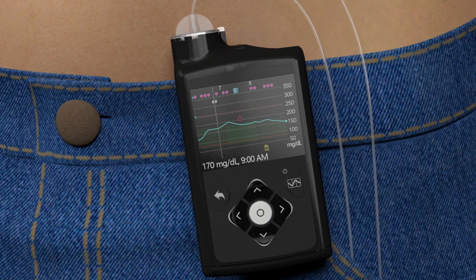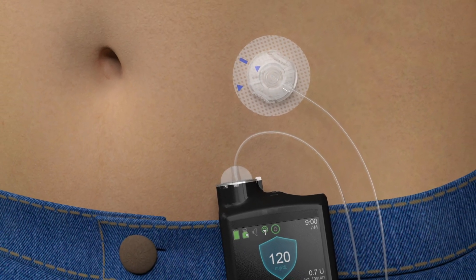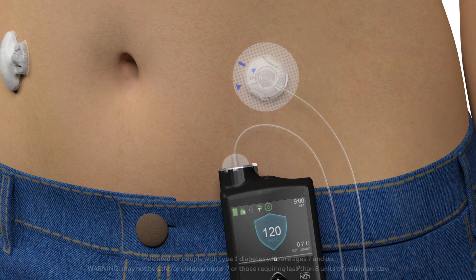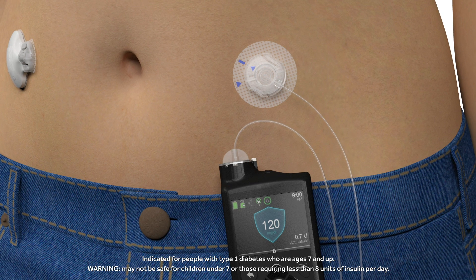This system can do much more than previous technologies. Those wearing the system simply input mealtime information, accept bolus correction recommendations, and calibrate the sensor a few times a day. The MiniMed 670G system is designed to learn a user's insulin needs and take action to minimize both high and low sugar levels.